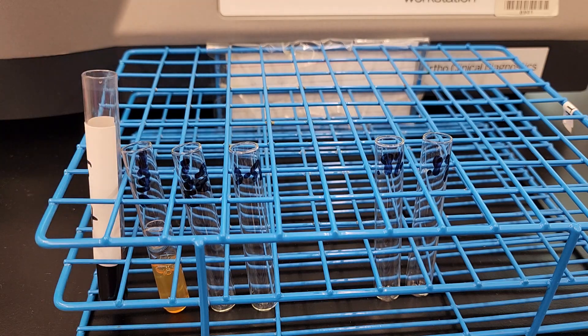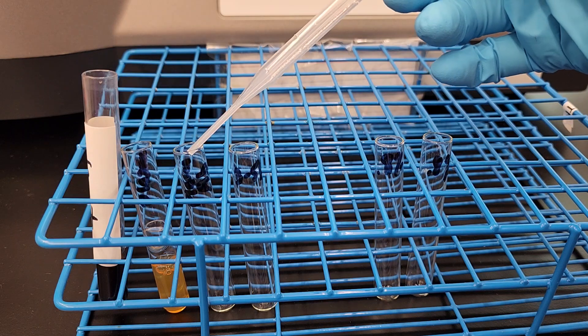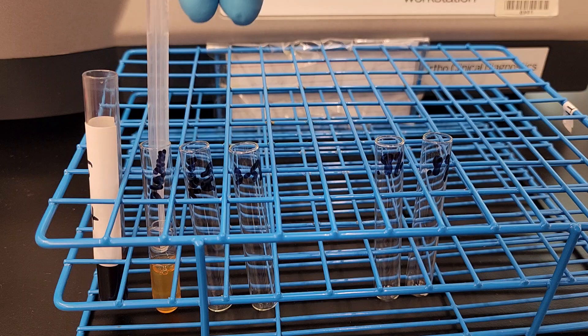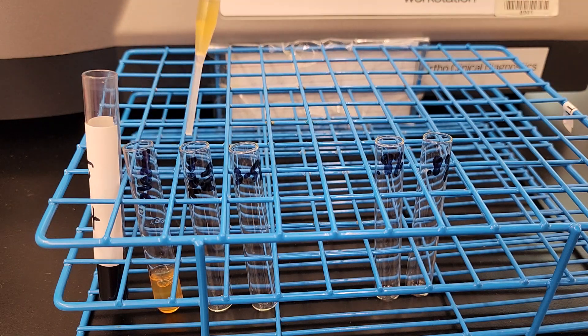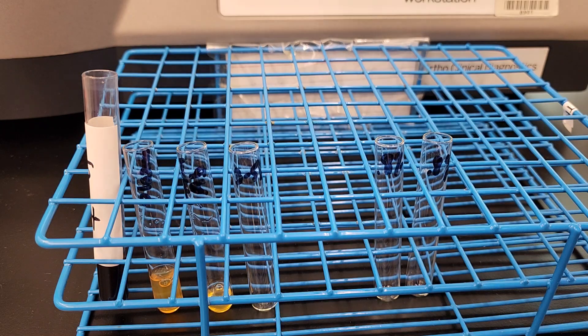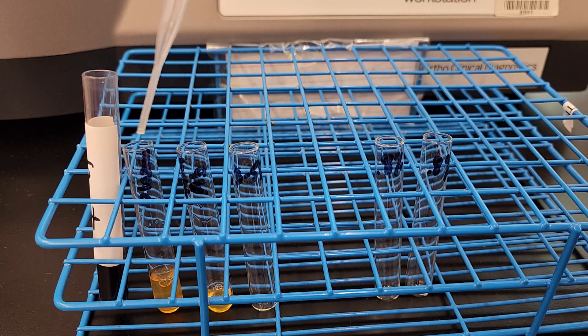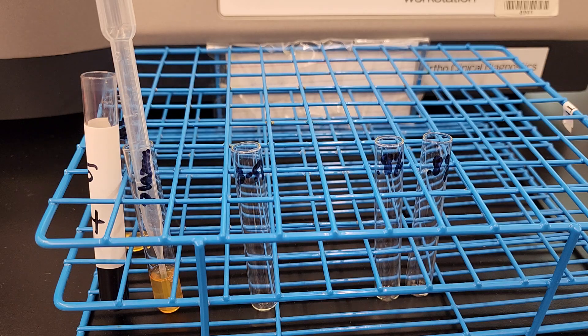You've seen this before in the making the red cell suspension video. Notice that I have another tube here. That's because I'm going to pull some out here. And this is probably what your professor does in order to give you an antibody to identify. I pulled that out because I'm going to add antibody to it later for another video so we can do gel testing.